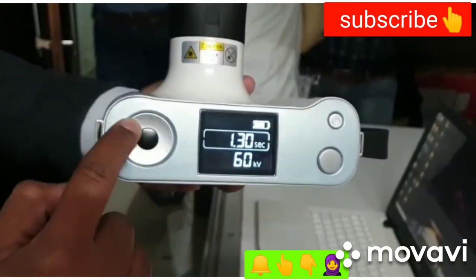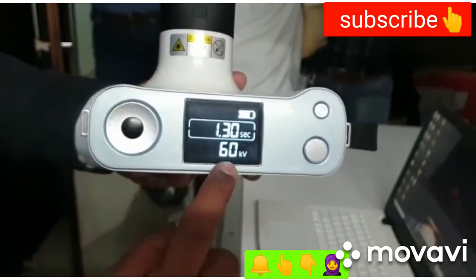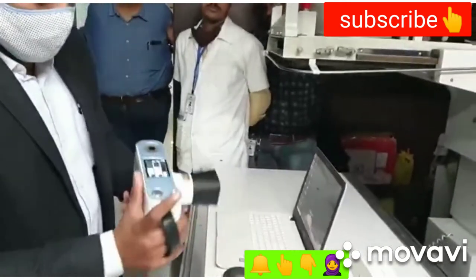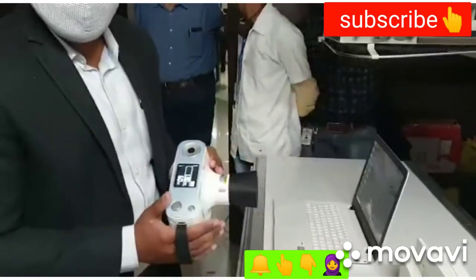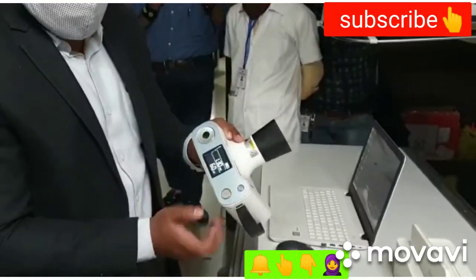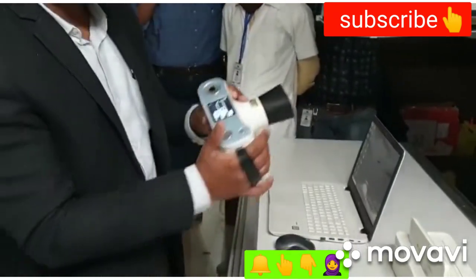The only adjustment you can make is the time. The kV is fixed — this is the tube voltage, which remains fixed at 60 kV. You have a two-way exposure button: one is at the top — press it here to activate the beam.